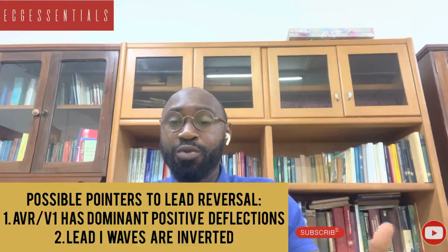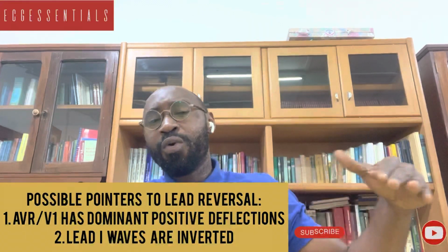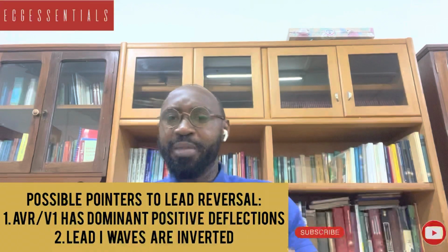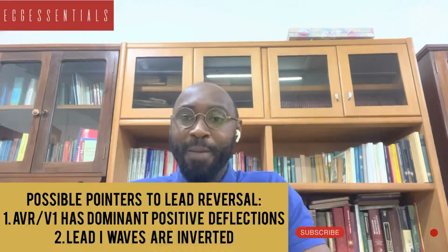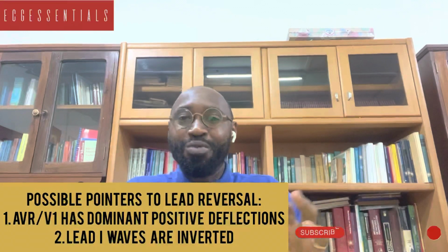Another way probably to find out that is when we see that in lead 1, all the waves, that is P wave, QRS, T wave, will become inverted. So an appreciation of how we expect these various waves to appear is important, so that we will be able to put our interpretations into context before we start going to town with very wild differentials.